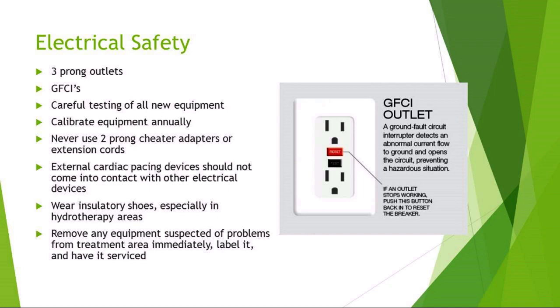You don't want to get electrical devices in contact with external cardiac pacing devices. You want to wear rubber-soled, insulatory shoes, especially in hydrotherapy areas. Any equipment that you suspect has a problem, you want to remove it from the treatment area immediately. You want to label it, red tag it, or whatever the procedures are for your clinic, and have it serviced before you use it on another patient. So electrical safety is important. Even though we're talking about really low amperages, we don't want to take the risk of hurting someone.